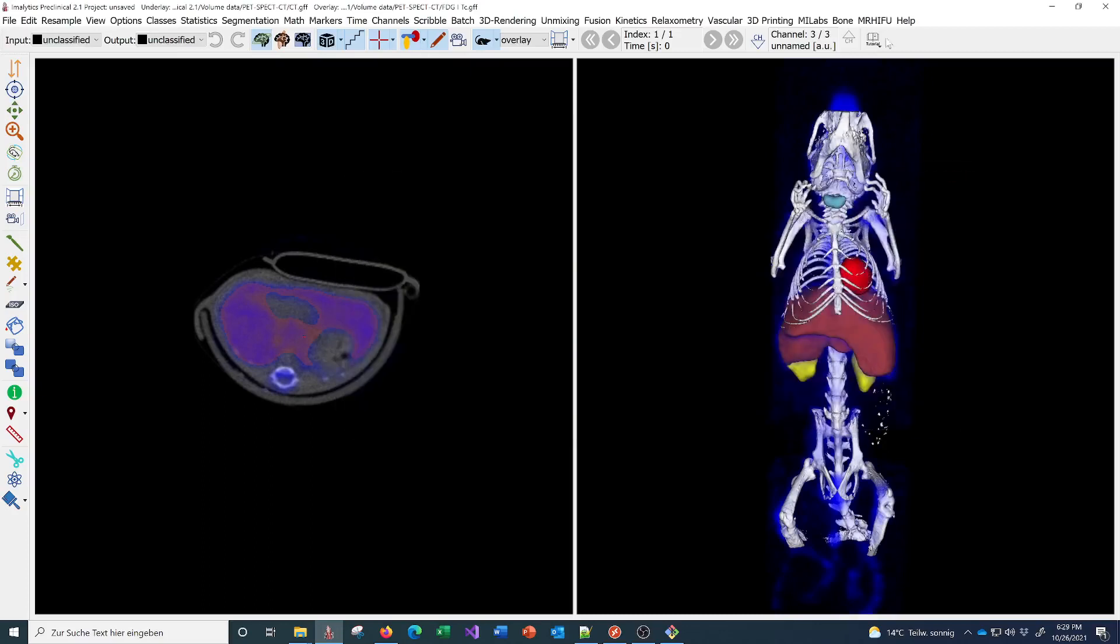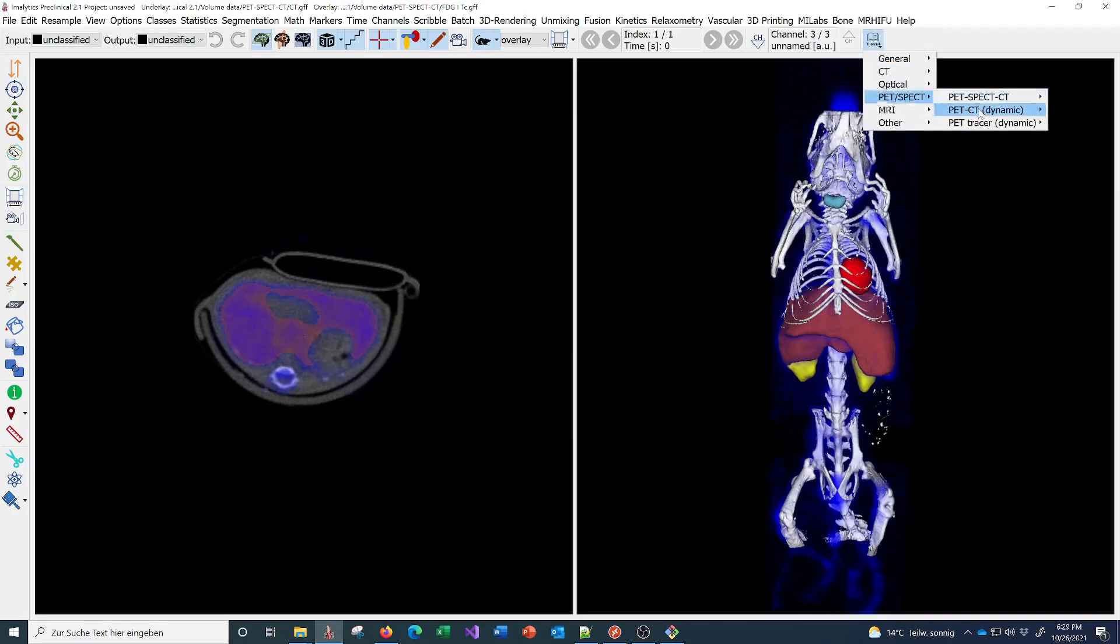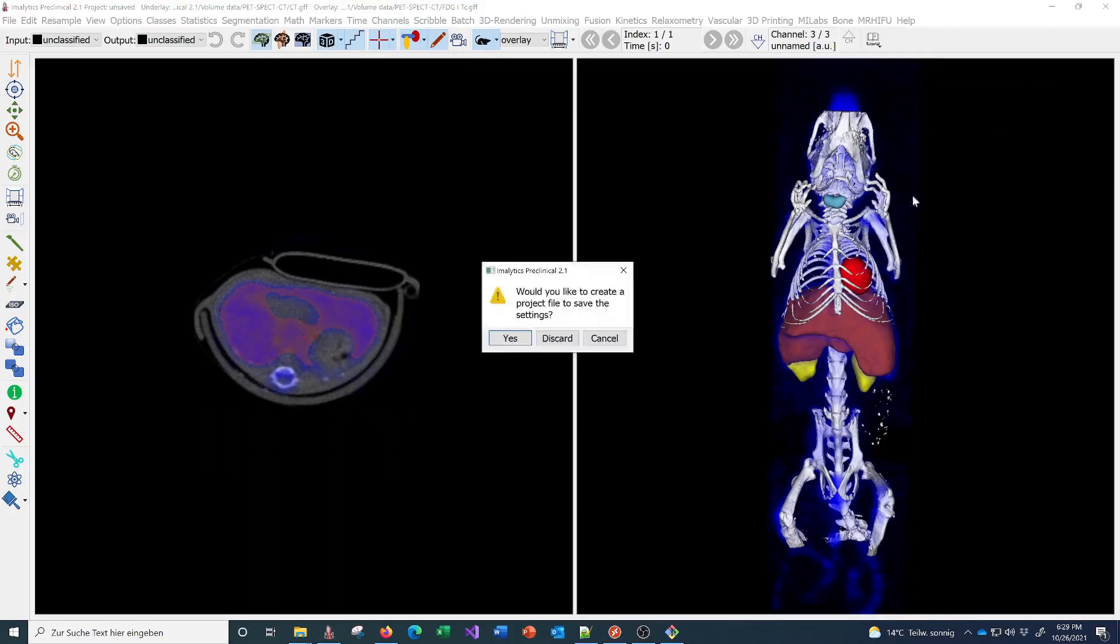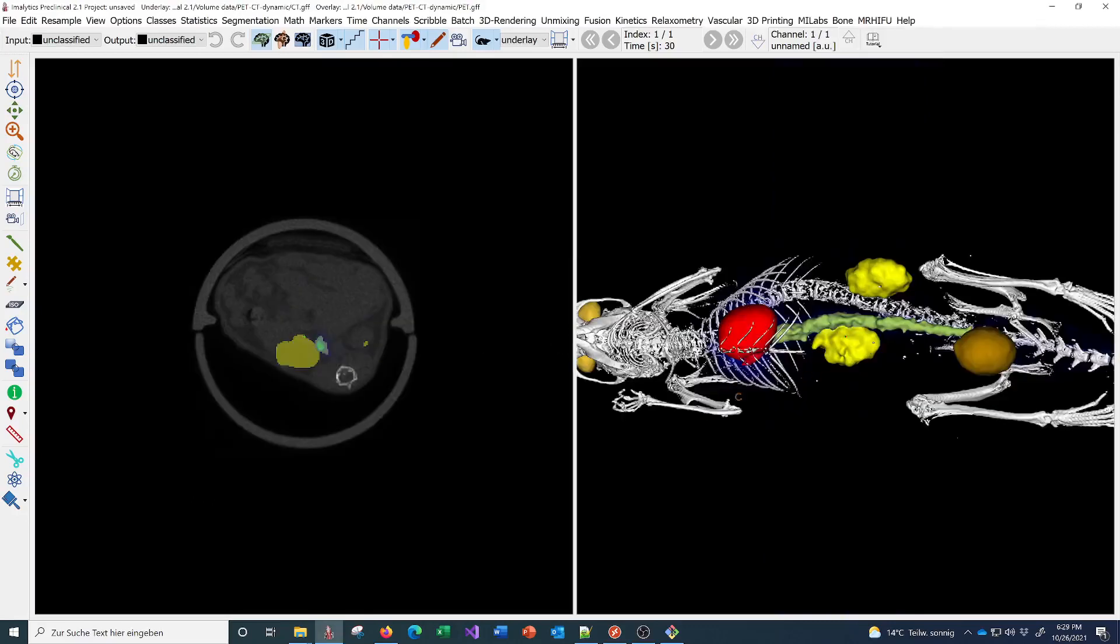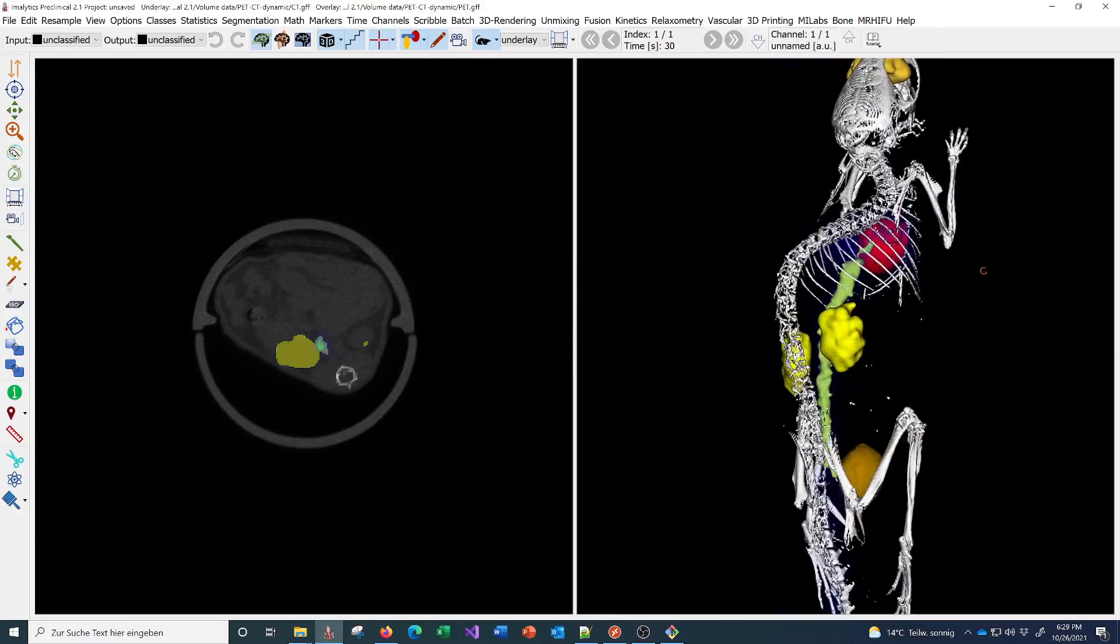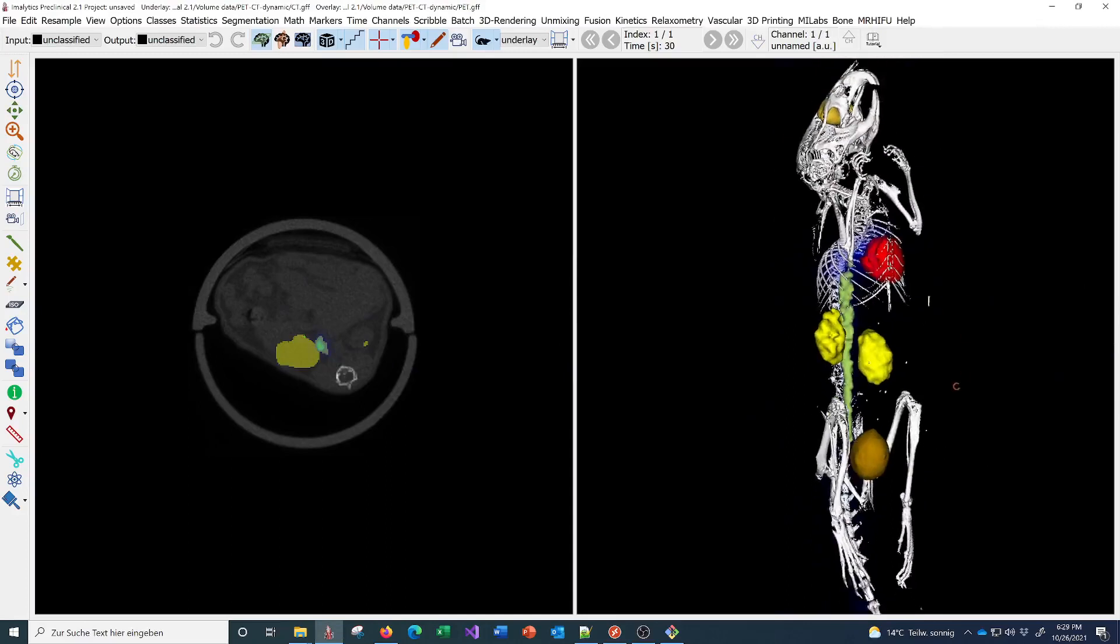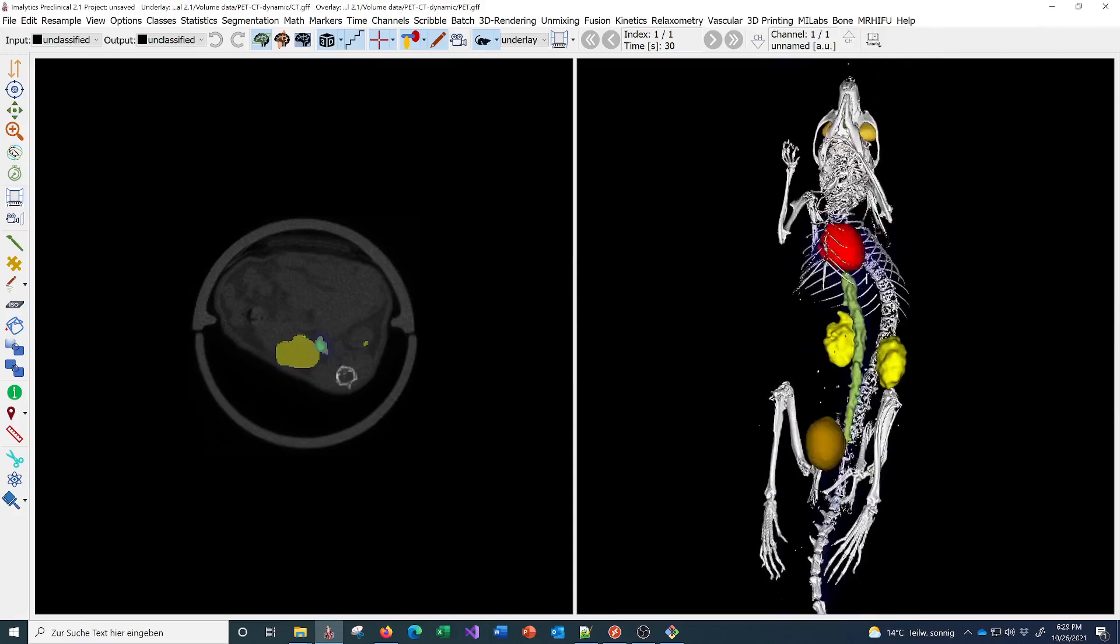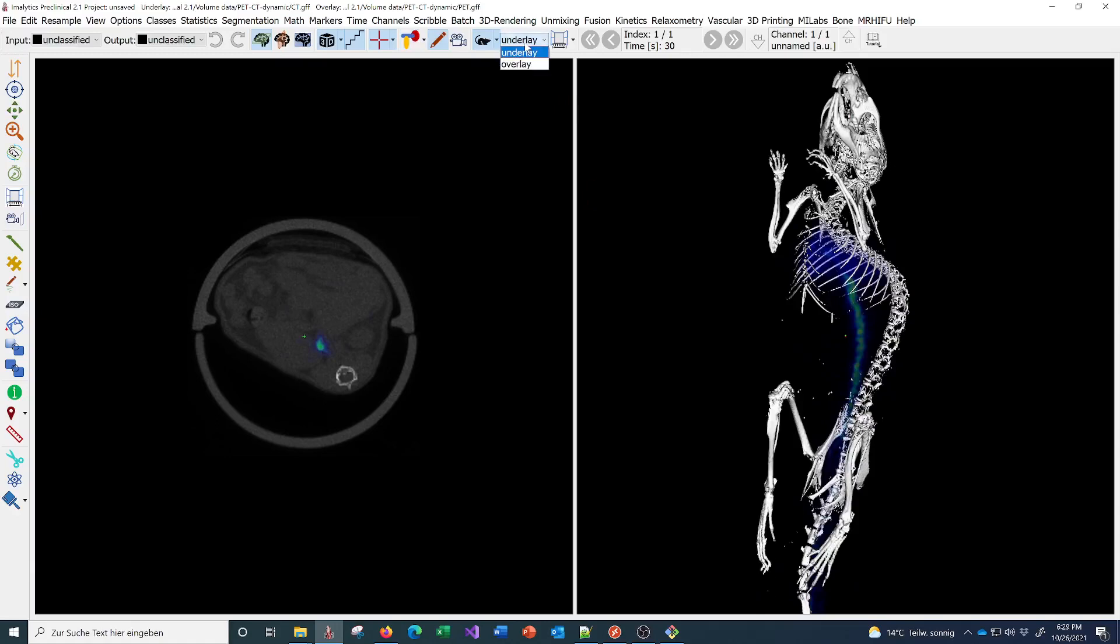You can also process 4D data. Here I can load the dynamic dataset from a PET CT with an injection of FDG. Here we can select which layer to operate, underlay or overlay.